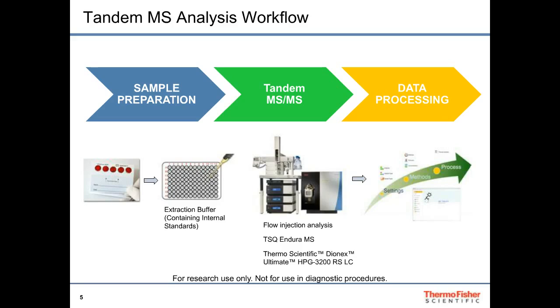Instead, we do flow injection analysis. So with each injection, the mass spectrometer applies ionization source conditions, as well as mass filtering and collision-induced dissociation conditions that have been optimized for each analyte and its internal standard, so that selective monitoring for each is recorded and processed. In addition to the software used to control the hardware and process the raw data from the mass spectrometer in a generic fashion, we have a special software tool called IRC Pro that you see over on your right, which takes that raw data and automatically quantitates analyte concentrations and performs custom calculations such as analyte ratios.